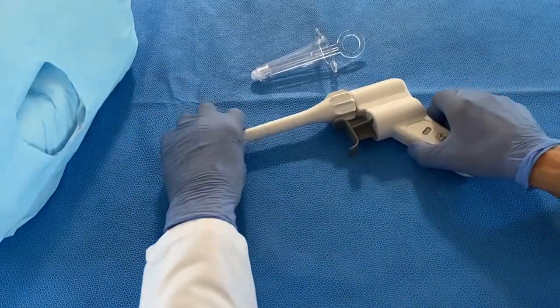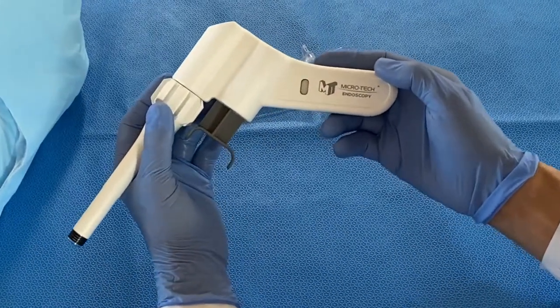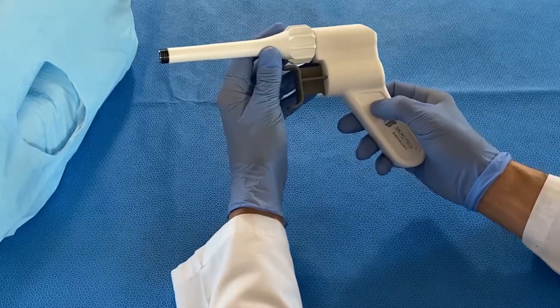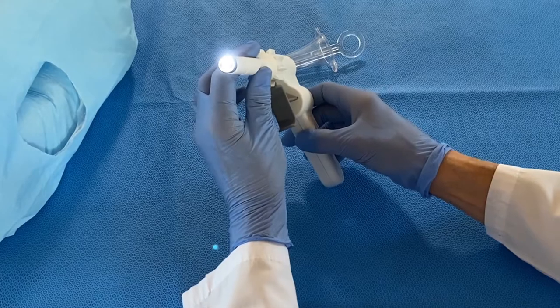The new Insight Ligator is manufactured and distributed by Microtech Endoscopy. It is the only ligator that has an incorporated light and will allow you to band under direct vision.